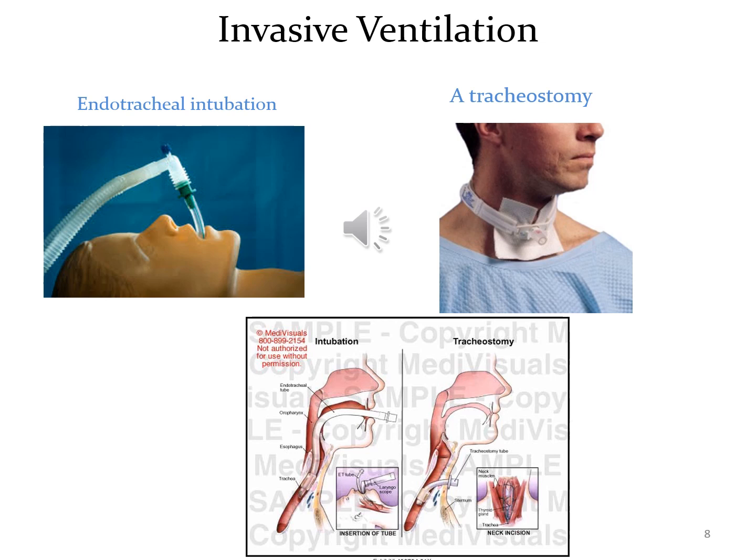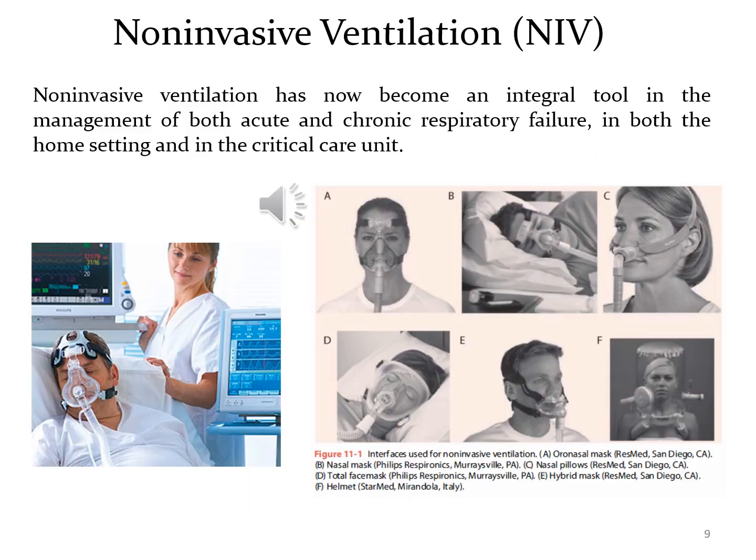Endotracheal intubation is when a tube is placed via the mouth or through the nose to provide an airway for short-term protection of the airway. Non-invasive ventilation (NIV) refers to the administration of ventilatory support without using an invasive artificial airway, endotracheal tube or tracheostomy tube.